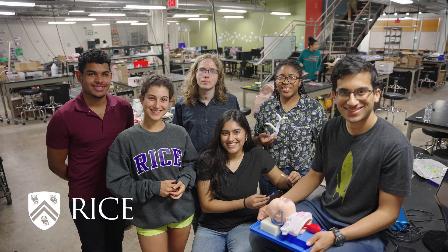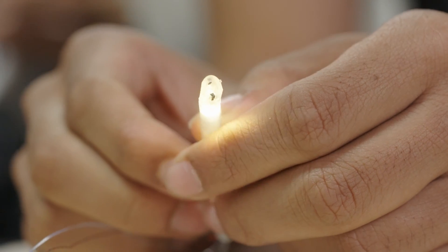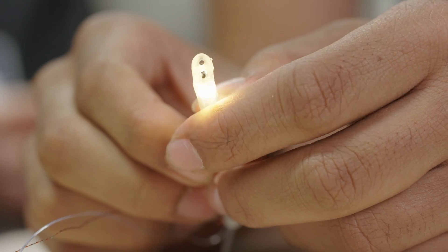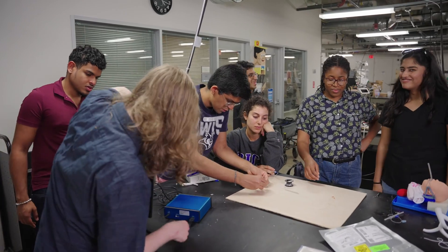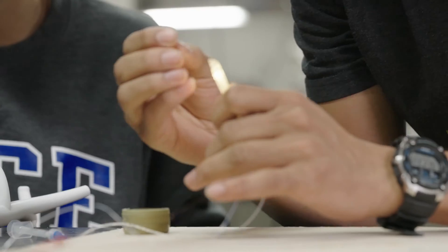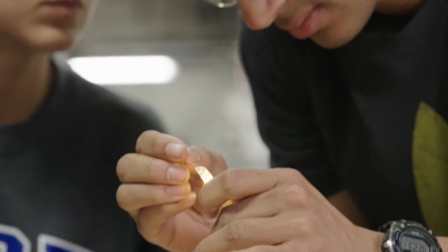Our team is Tiny Trach. We're making a camera-aided endotracheal tube. We have an interdisciplinary group of mechanical engineers, electrical engineers, and most of us are bioengineers. We make up a group of seven and we all bring our different skills to try and make the tube work.